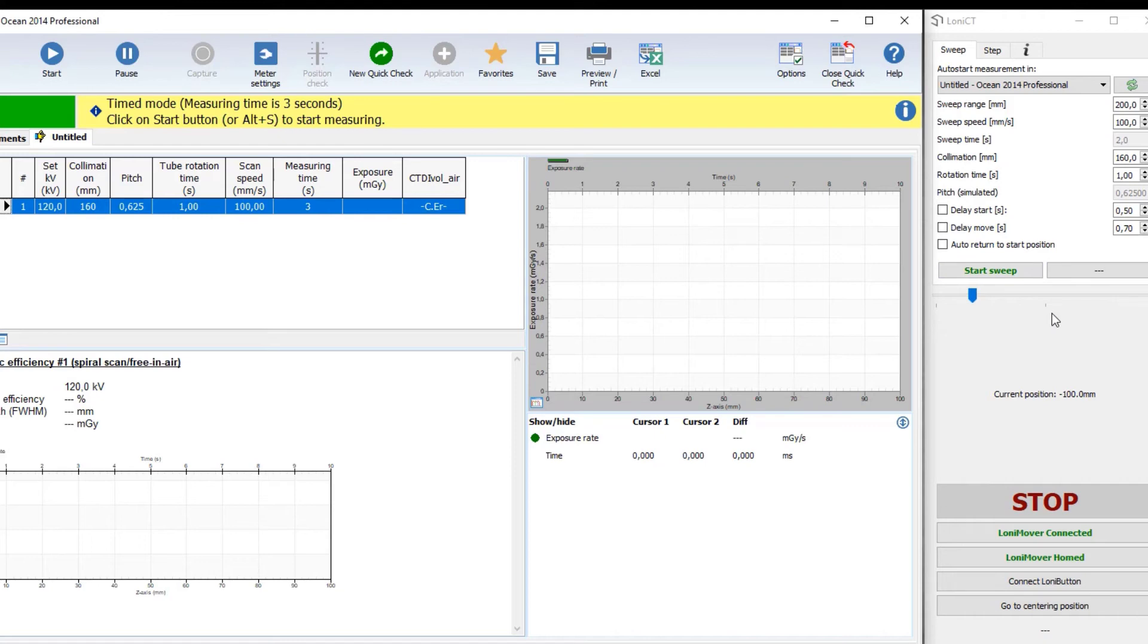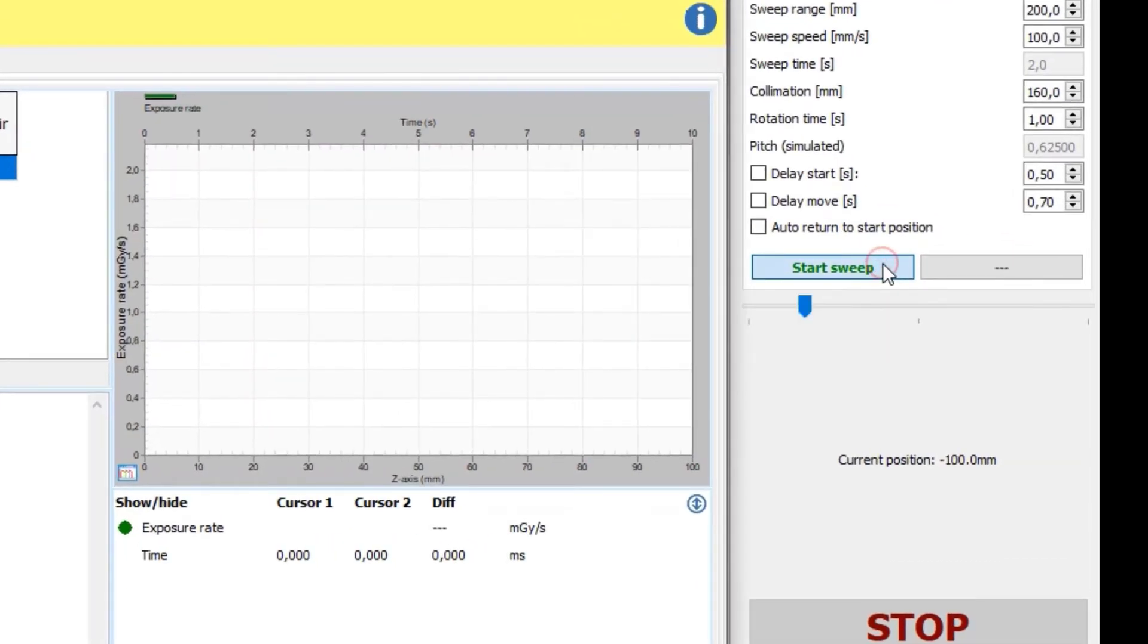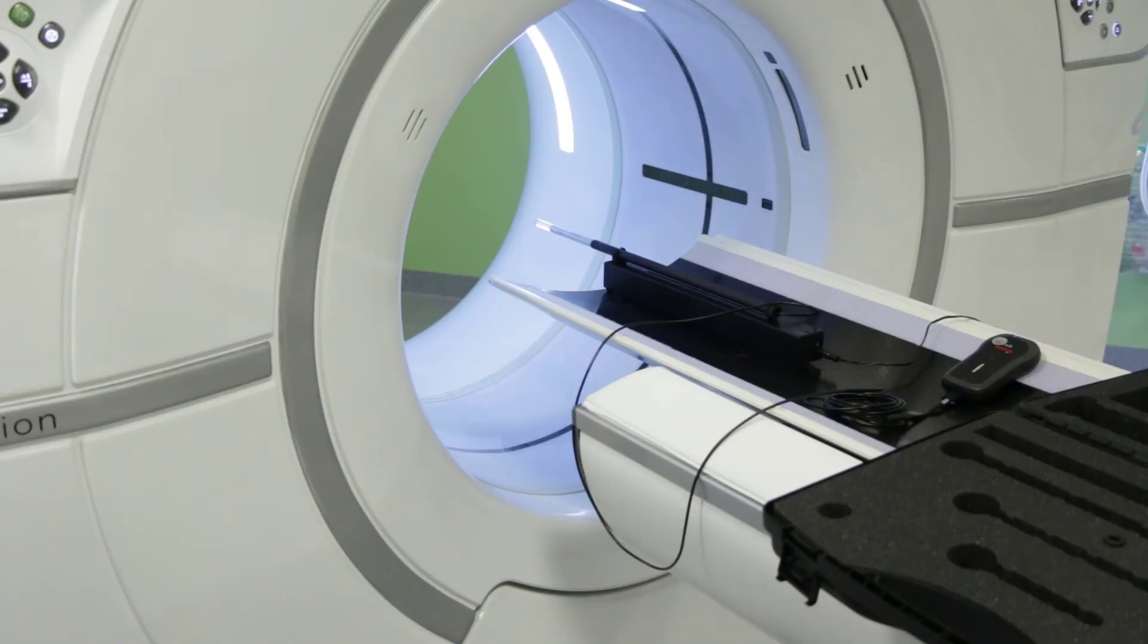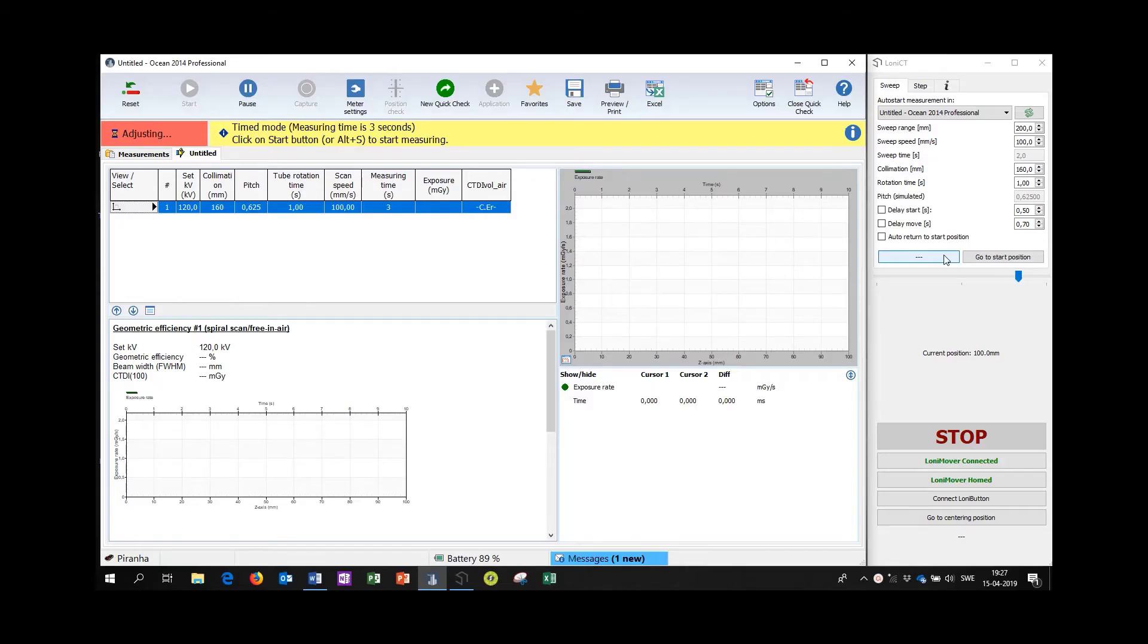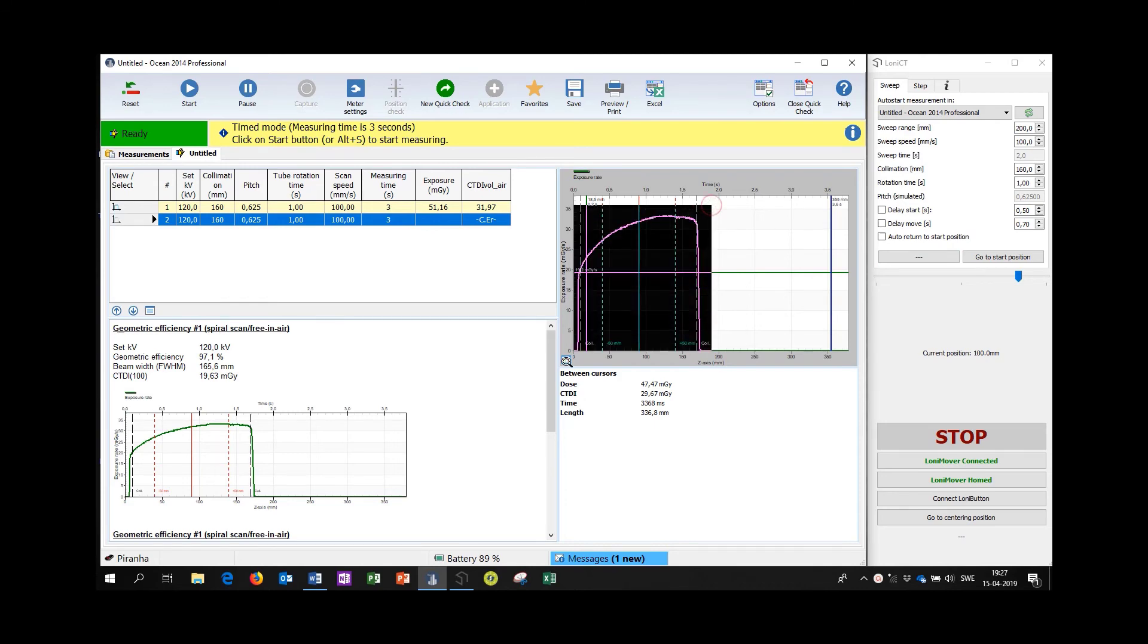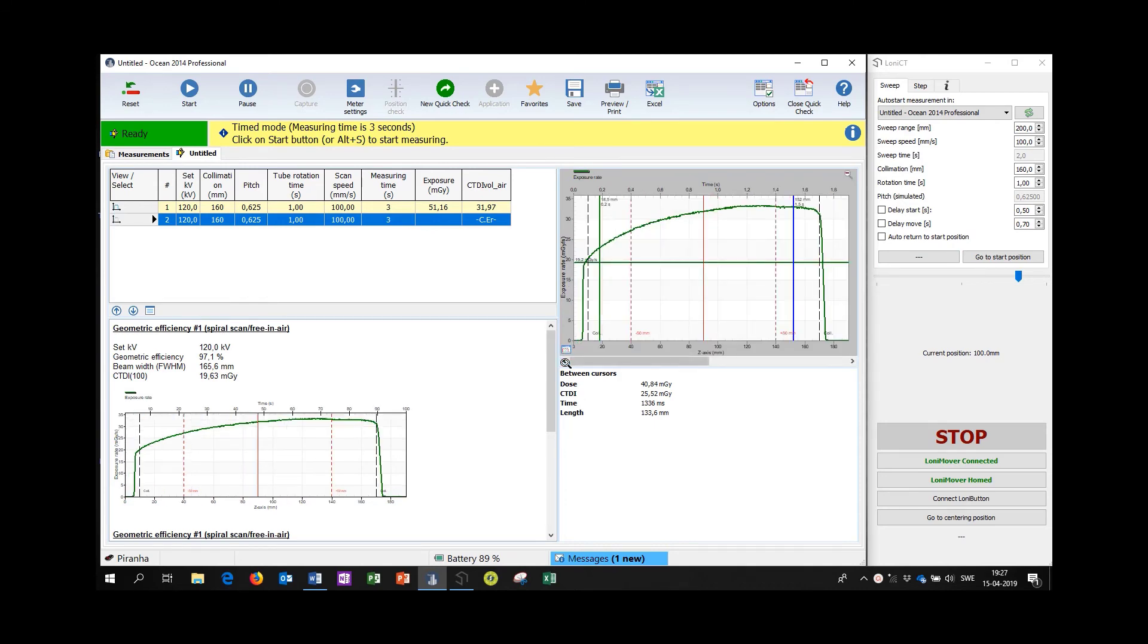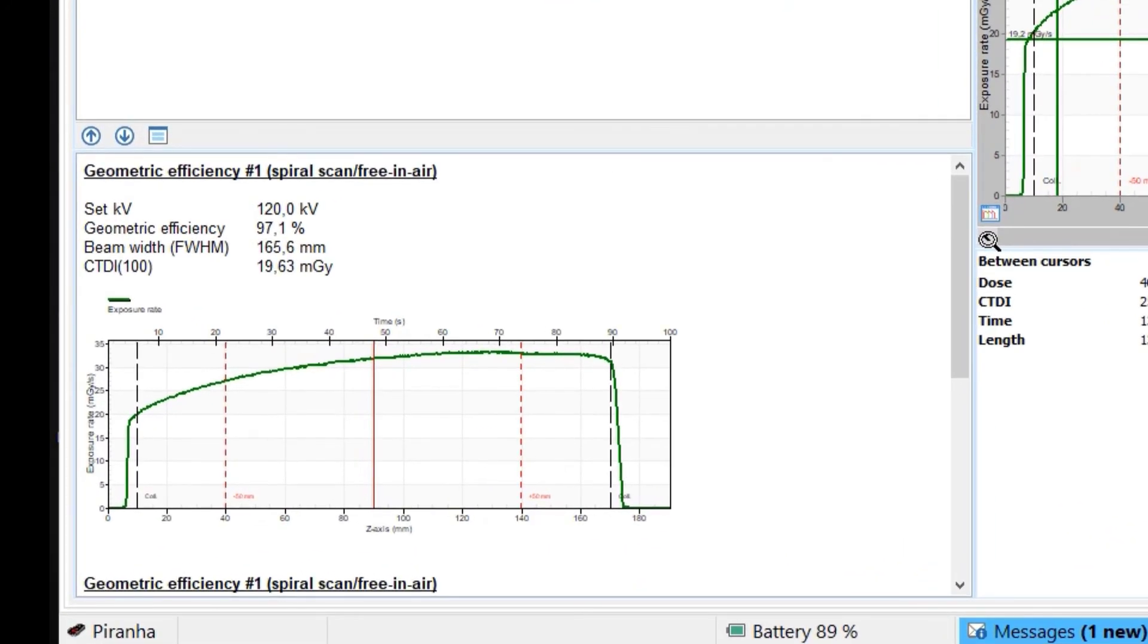The LONI mover is activated during the exposure and after completed sweep the data is presented in the ocean window where we see that the full width half maximum is 165.6 mm for this 160 mm collimation.